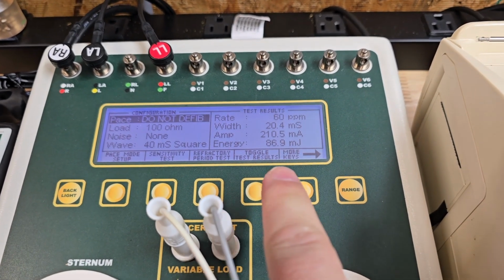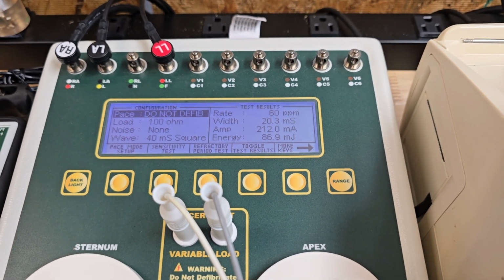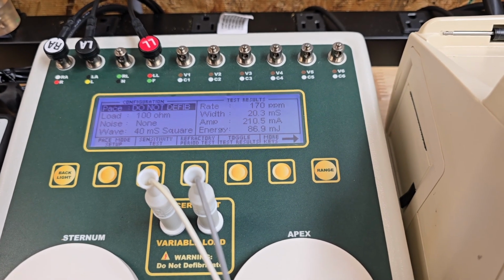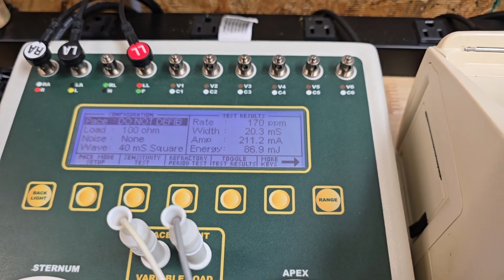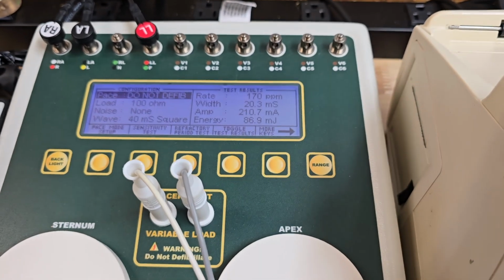And you can see right here, we have 210 milliamps and we're still sitting at the 60 ppm. Let's go ahead and turn that up because what if it's a baby? What if it's a child? Children, their heart beats at a much higher rate. And you can see I am up there at 170 ppm.